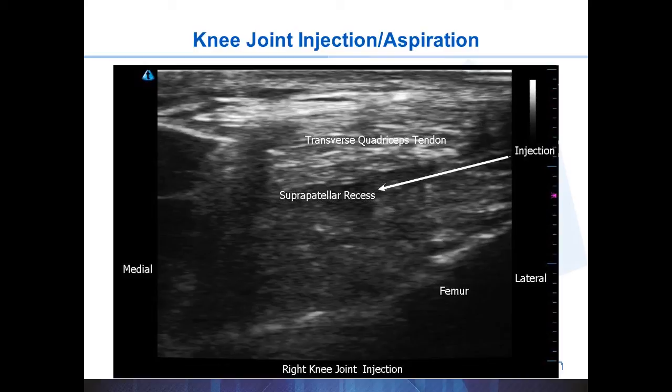In this image we have the soft tissues and the transverse quadriceps tendon. A small effusion in the suprapatellar recess appears hypoechoic. Beneath it is the pre-femoral fat pad, and we see hyperechoic lines of the femur with posterior acoustic shadowing. The injection again starts not at the corner of the probe but one or two centimeters below, so it can come in very parallel and very visible.